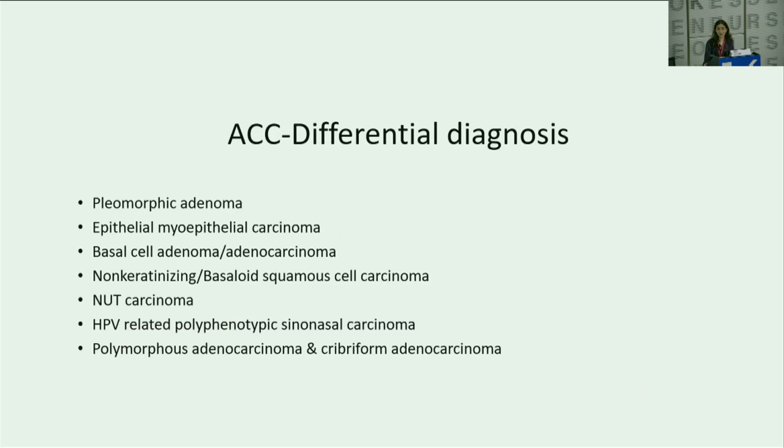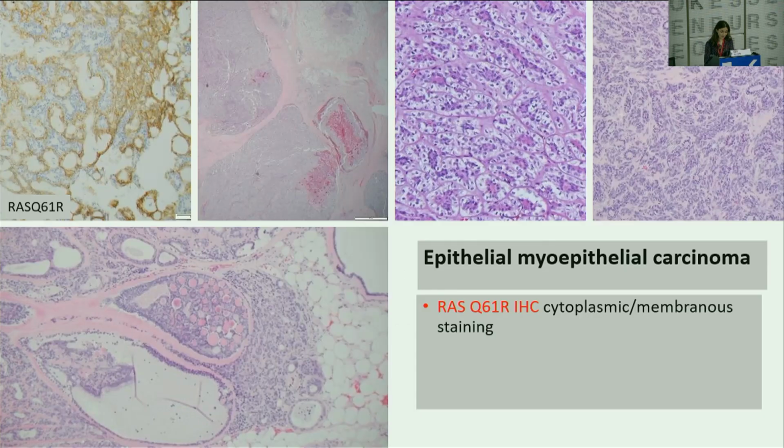The differential diagnosis of adenoid cystic carcinoma is broad and includes many entities. When the tumor is conventional, and especially tubular, adenoid cystic carcinoma can look similar to epithelial myoepithelial carcinoma, especially in small material. In resection, the multinodular growth pattern we see in epithelial myoepithelial carcinoma, with the compact architecture with the epimyoepithelial unit we talked about, and the scant hyalinized stroma in between, can help to differentiate epithelial myoepithelial carcinoma from adenoid cystic carcinoma. Additionally, a cribriform pattern can be seen in epithelial myoepithelial carcinoma; however, it's usually focal and not diffuse as we usually see it in adenoid cystic carcinoma.